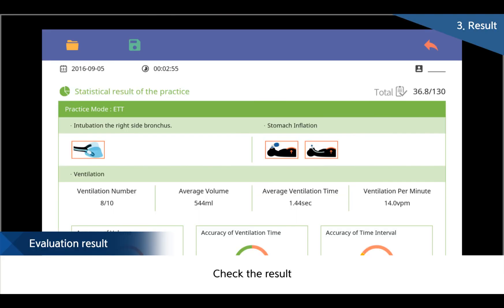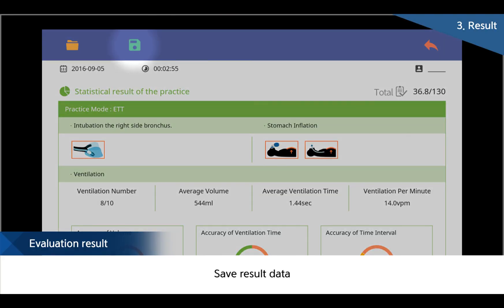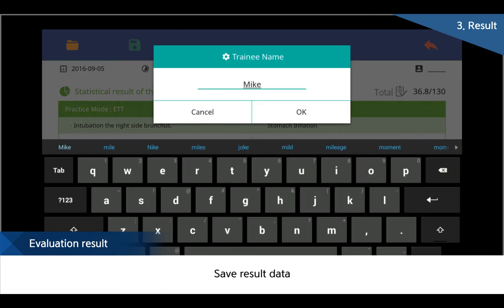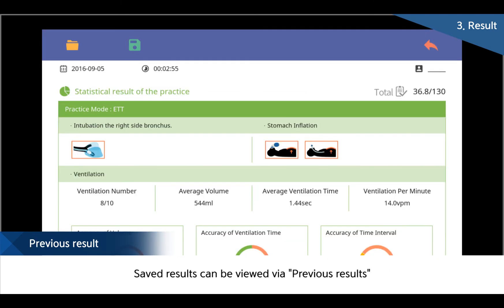After training, users' results and details during training can be checked through the result function. Results can be saved through save, and saved results can always be confirmed through the previous result function.